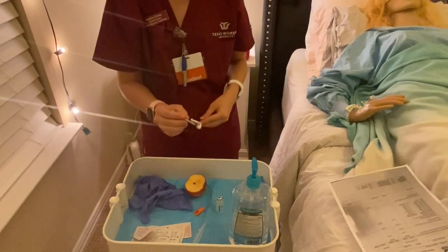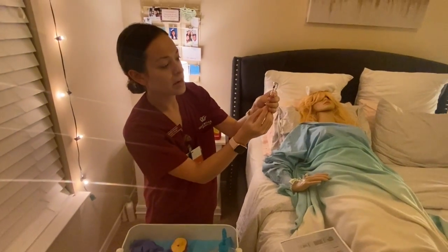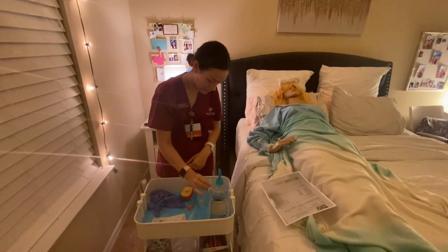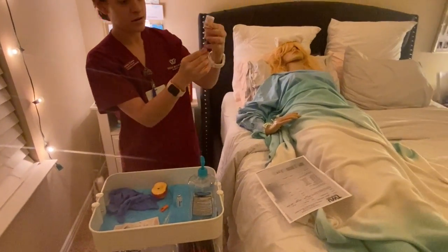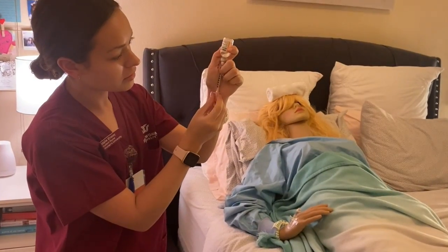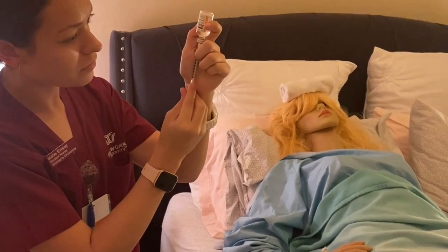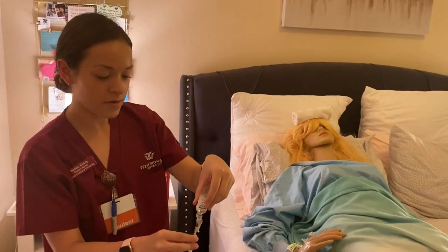Okay, and now I'm going to do 4 units of air, so right there, for the regular insulin. Okay, but this time I'm going to turn upside down and carefully aspirate 4 units of regular insulin. I'm just going to take it out.